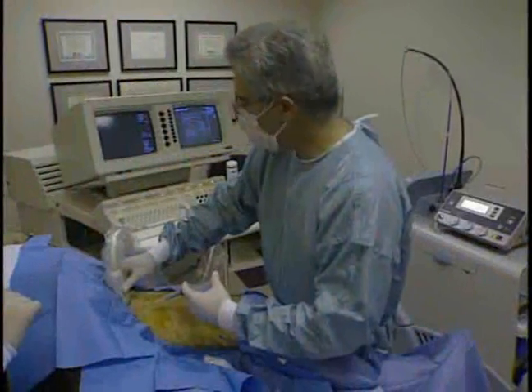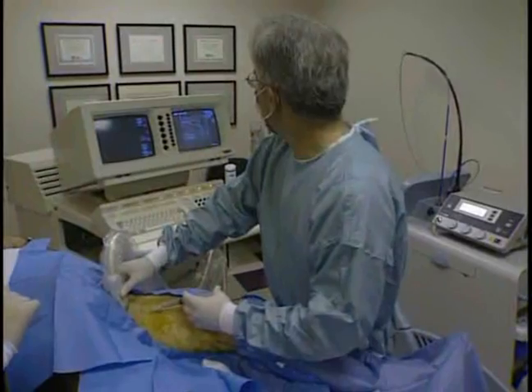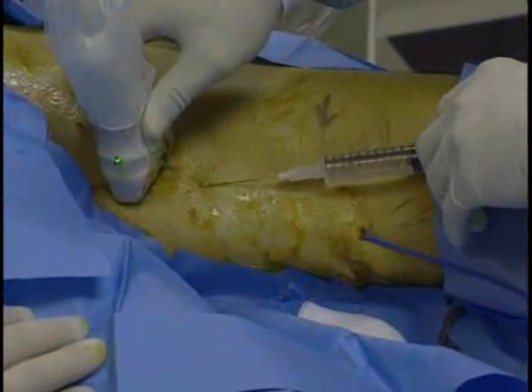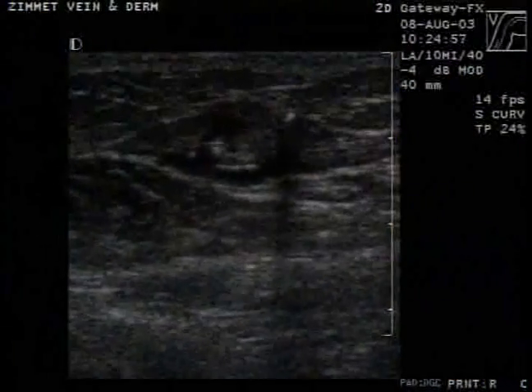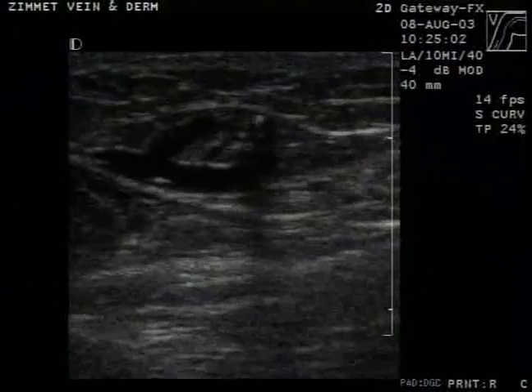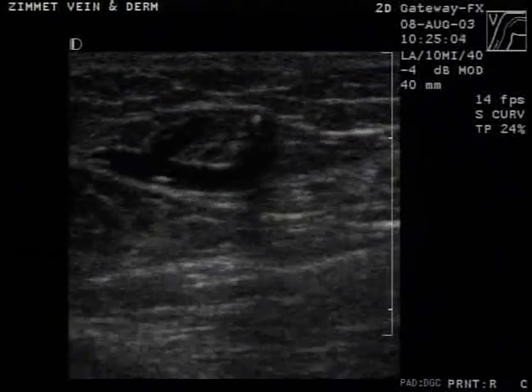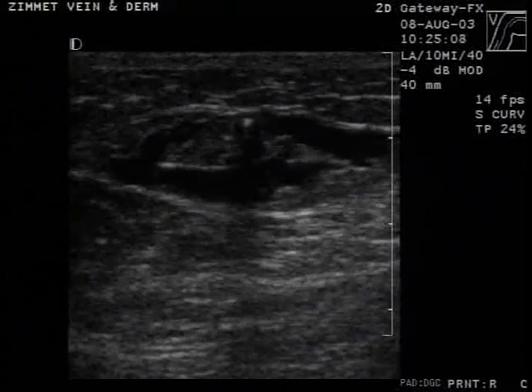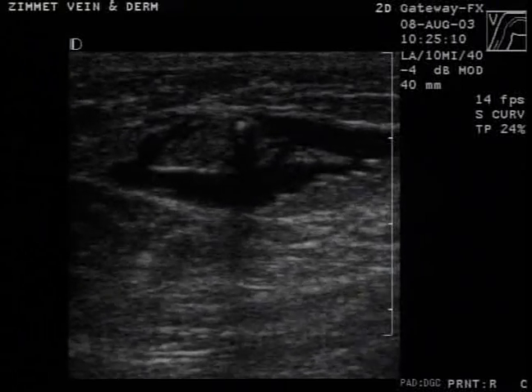Deliver adequate tumescent anesthesia, 0.2% xylocaine, under ultrasound control, intrafascially, around the GSV, from the SFJ to the point of needle access distally. In addition to the anesthetic effects, properly delivered, this fluid compresses the vein and provides a heat sink to minimize the possibility of heat-related damage to adjacent tissues.